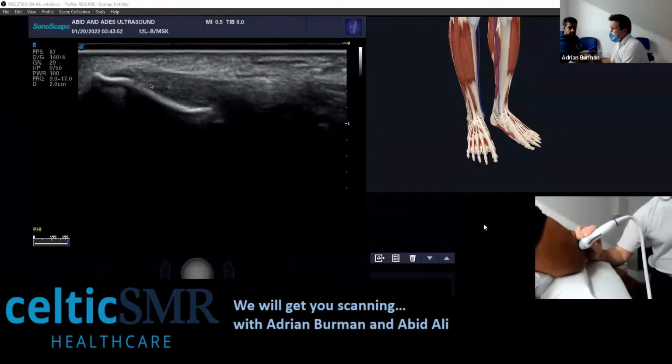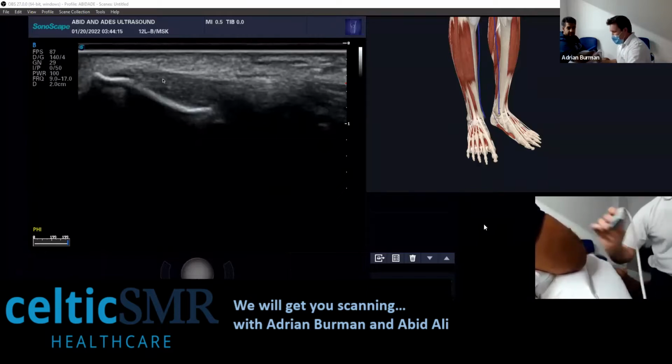You can see that. And then if you put the Doppler on, just remember to have the lightest touch possible. That will give you the best chance of seeing your Doppler signal. If you add too much pressure, you'll compress the vessels. And it's not necessarily a lot of pressure there, is it? Because it's quite a superficial structure. Yeah, exactly.